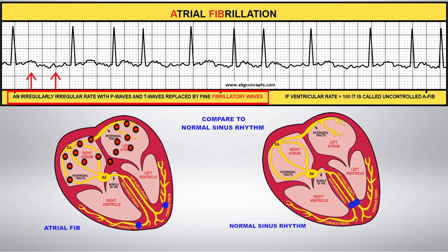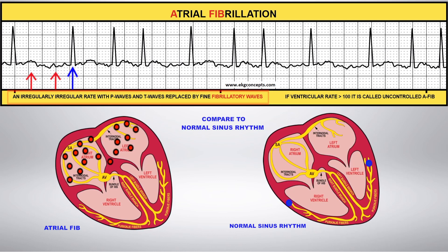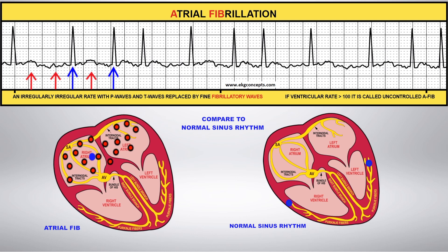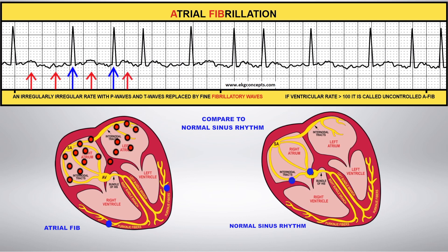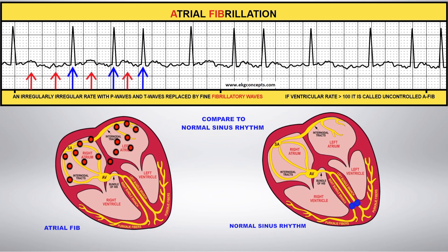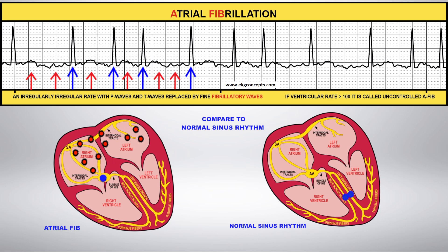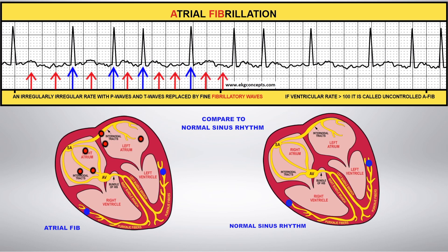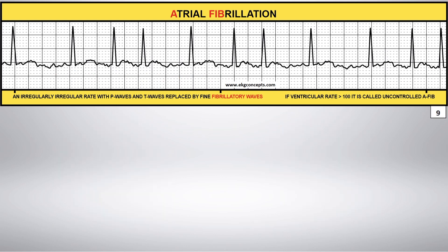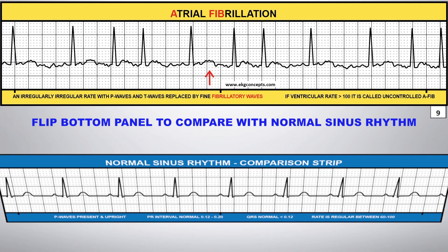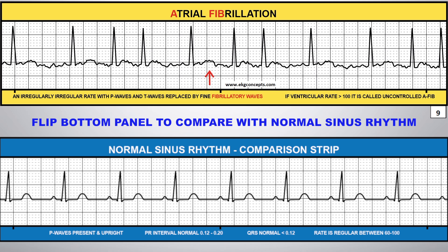Compare this to normal sinus rhythm. Atrial fibrillation is the most common dysrhythmia in the world. You can flip the comparison strip on the bottom panel to compare this rhythm to normal sinus rhythm.